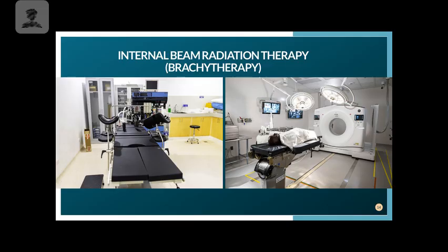So the CT is on rollers. When they're ready to image and ensure, like if they're putting in prostate seeds, that they're at the correct location, or just verifying where that radioactive source is, they will bring it this direction. And so the whole thing will slide, and you see how the table is completely empty underneath? That allows for the patient to actually move inside of the gantry of the CT machine. So they're able to localize everything and see what's happening.